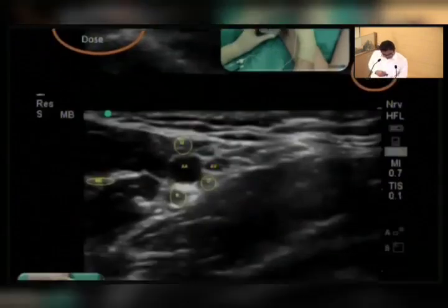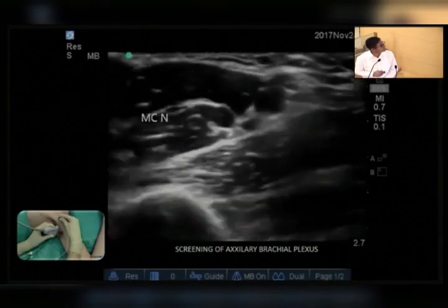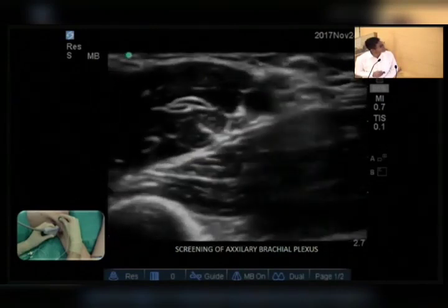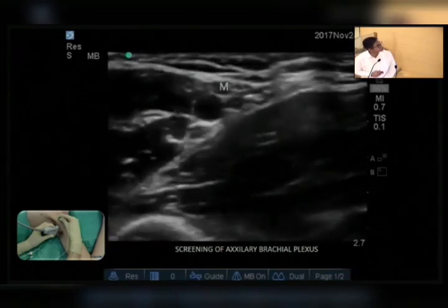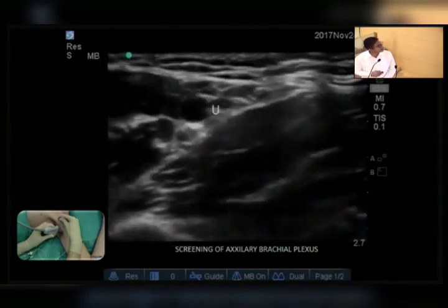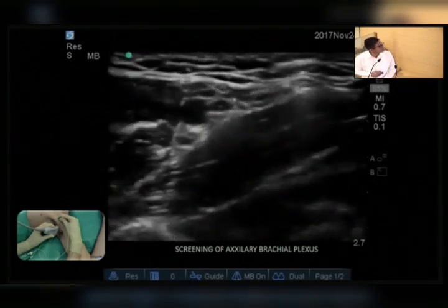First of all I scan for the musculocutaneous nerve, which lies between the biceps and coracobrachialis muscles, and the median nerve lies on top of the axillary artery, and the radial nerve lies posterior to the axillary artery, and the ulnar nerve lies mostly between the axillary vein and artery, at 3 to 5 o'clock positions. So let's see some screening. This is the musculocutaneous nerve. See, I'm just tracing back. This is biceps and this is coracobrachialis. This is the axillary artery. Somewhere you will find the median, ulnar, and posteriorly to it is the radial.